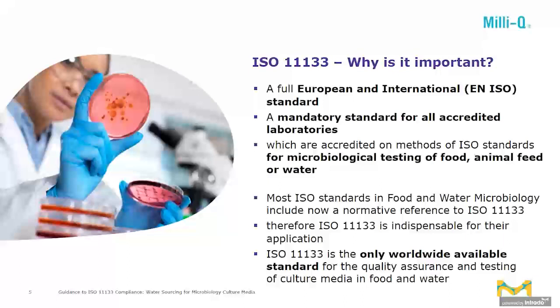First, the ISO 11133 is an EN ISO standard. That means a full European and international standard. It is a mandatory standard, meaning it is a requested standard for all accredited labs which are accredited on methods of ISO standards for the microbiological testing of food, animal feed or water. Accredited means here accredited as a testing lab for samples from food, animal feed and water for the microbiological testing. And the accreditation is according to ISO 17025.